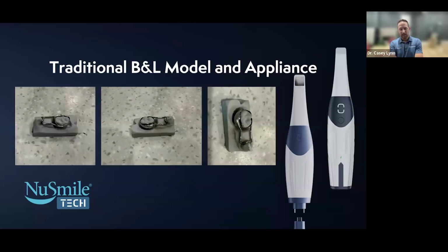He had a big abscess. It was a hot tooth, and he did not love the actual dentistry, but getting this cemented was not an issue because it was a try on and then cement. It fit like a glove. I didn't have to modify it at all.